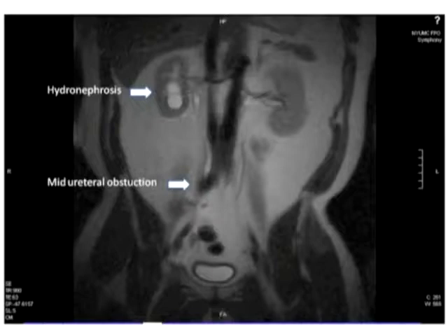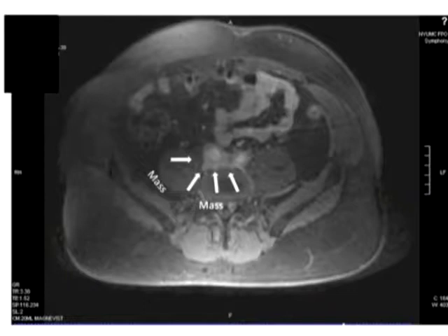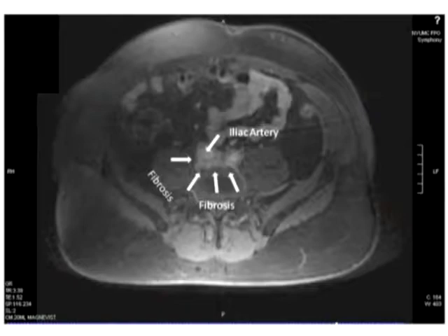On this film you can see a mass which is surrounding the iliac artery. This is consistent with retroperitoneal fibrosis, and the ureter can be seen medialized and obstructed by this mass which surrounds the iliac artery.